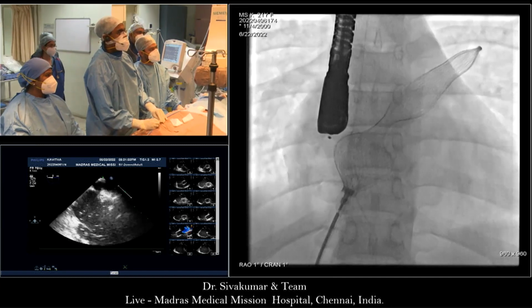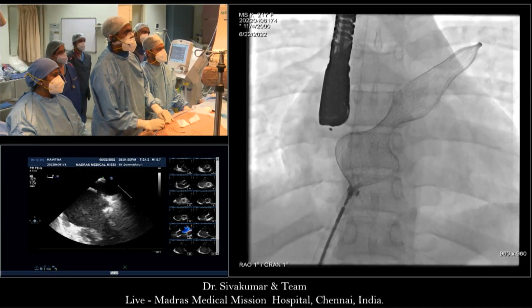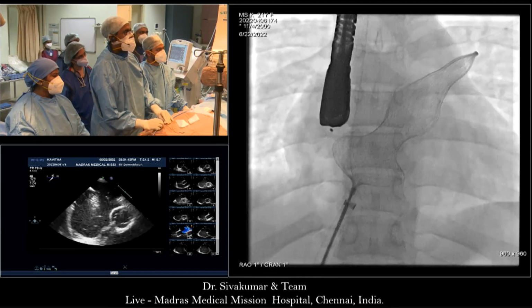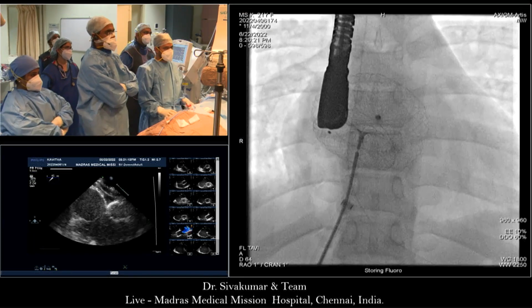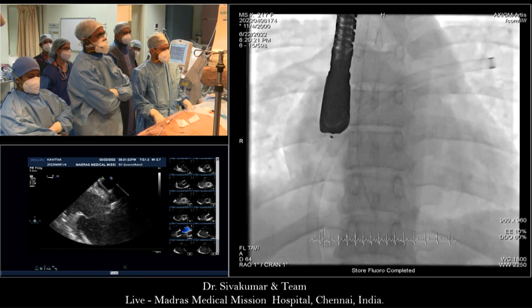Show my RA disc, Srija. Now tell us, go on, Shiva. Tell us what you're doing and what you're thinking. So now, once again, I'm just confirming that my device has reached the RA. There you go. Fluoro, store this. Yeah. Right. So store that, but talk us through what you did, because your hands were probably doing something different.